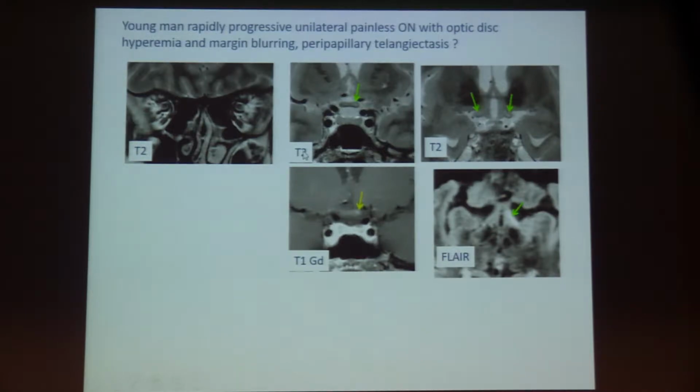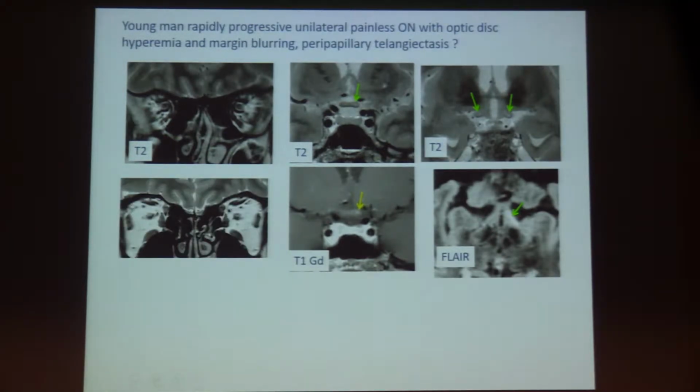This is an image we are not used to seeing. We see this disease much later, at a stage when the patient is sometimes blind, because this is a disease that can lead to blindness, and when the optic nerves are very small. This is Leber disease.